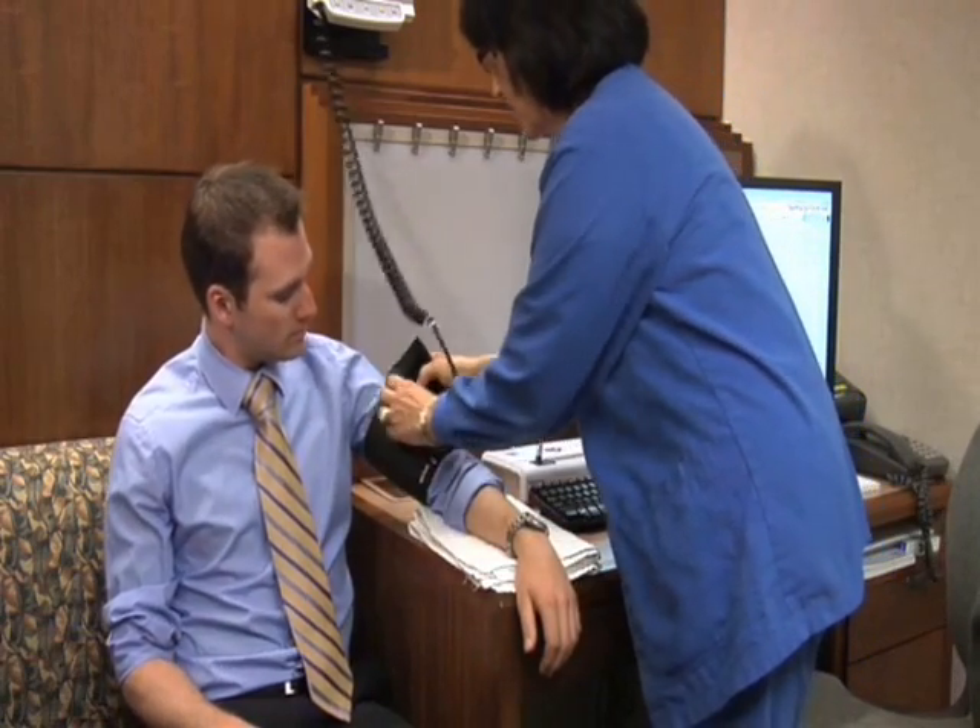The blood pressure machine is finished, and your blood pressure is 108 over 70. I'm going to remove the cuff now.